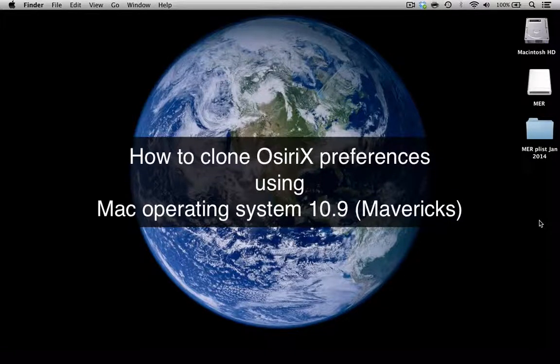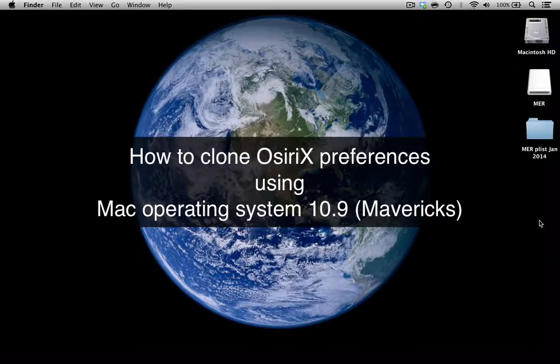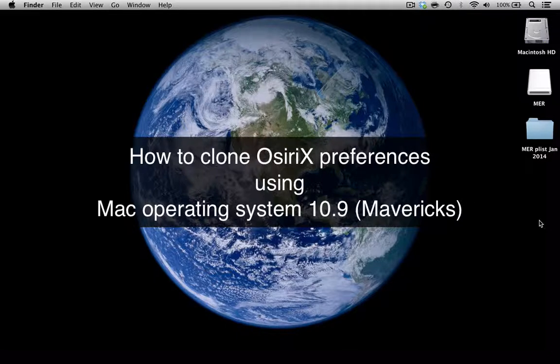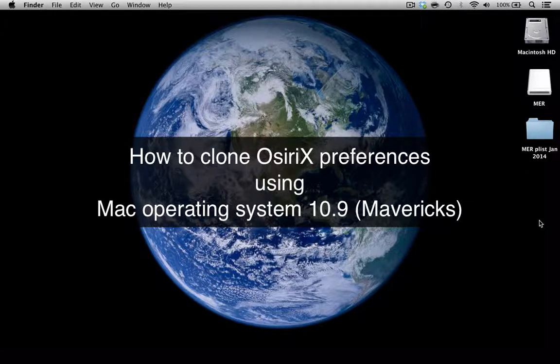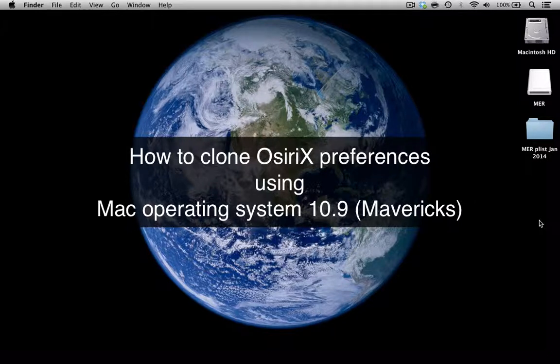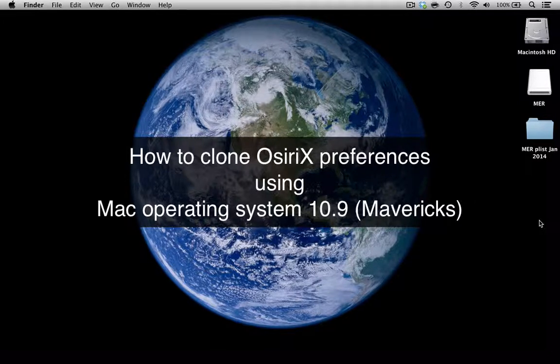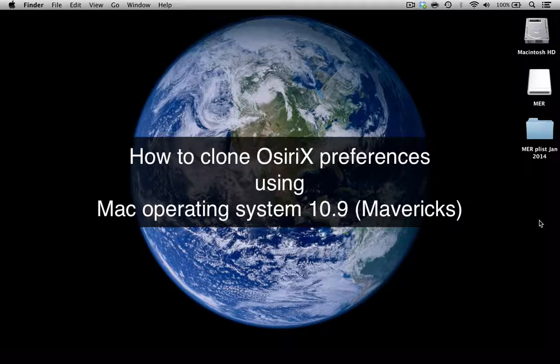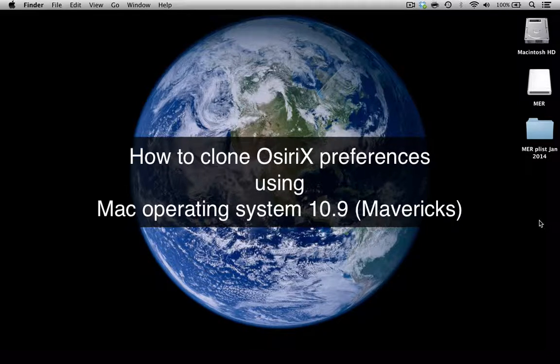Hello, my name is Mary Roddy from the UK OSirX user group, and today I want to talk to you about how to clone your OSirX preferences using the latest Macintosh operating system 10.9 or Mavericks.